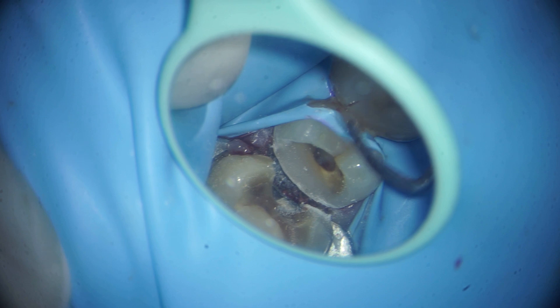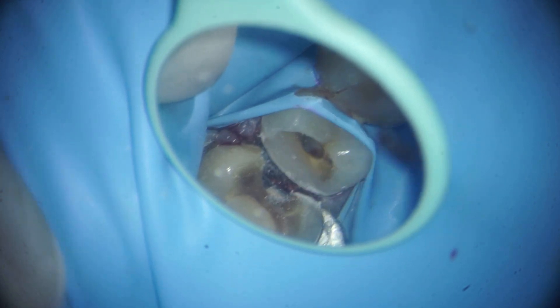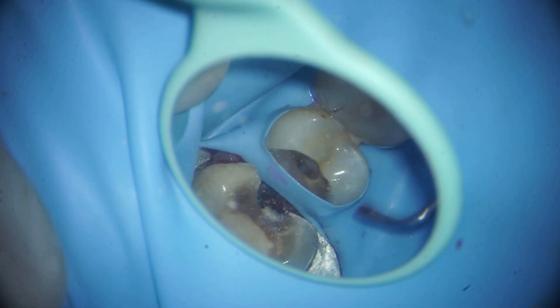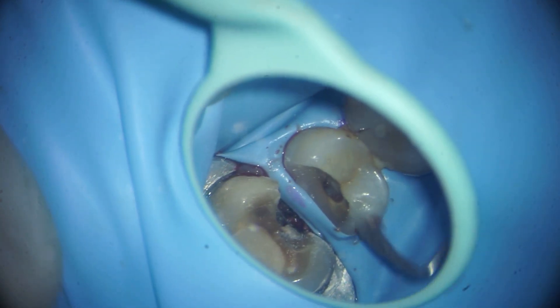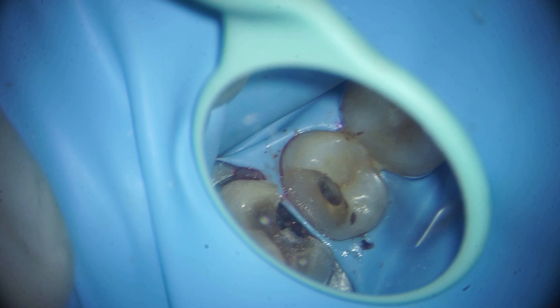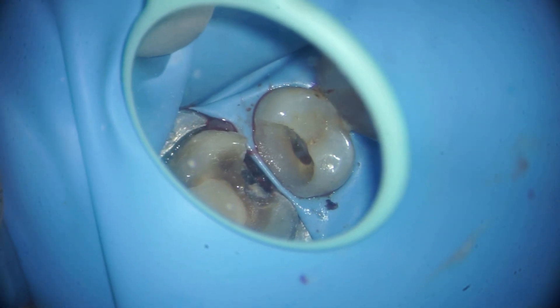Our coronal seal will be very efficient. You can see that I have tucked this rubber dam margin on the other side, and now I am bringing it back below. It is now easier to invert the rubber dam below the margin of the restoration.